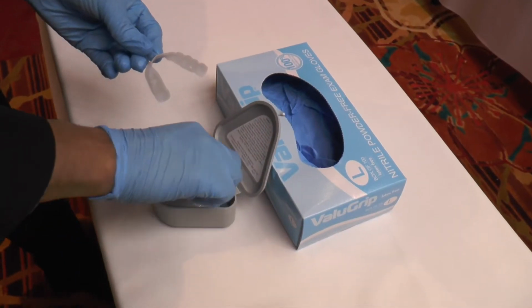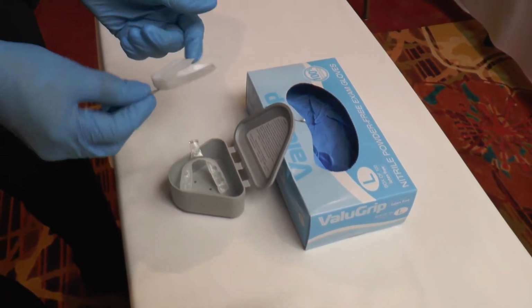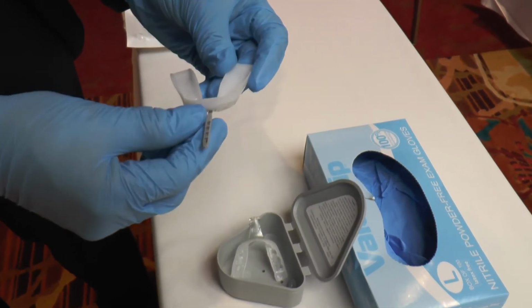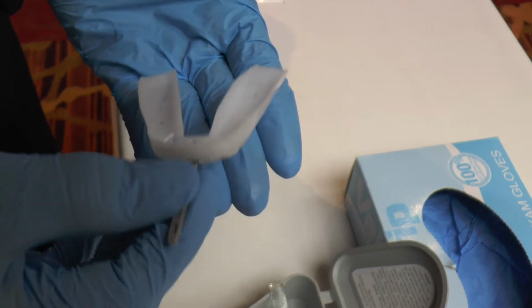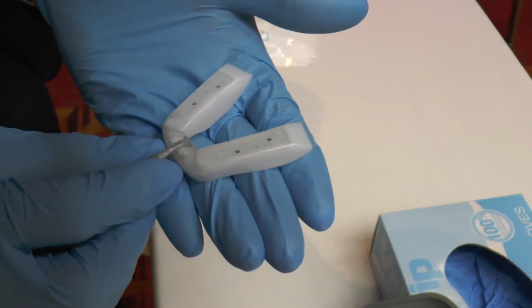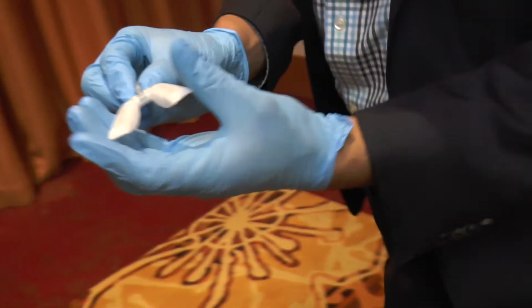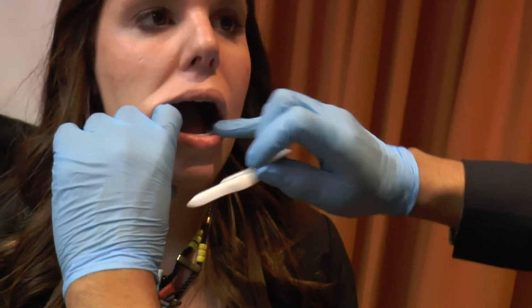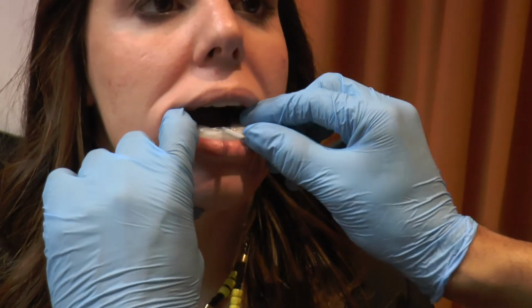So what we're going to do now is just set the upper tray in this carrying case and take the lower tray, and we're going to get it ready to be molded in the lower. The first thing, as always, you want to try the tray in to understand whether you have to modify it to allow a little bit better width or contract it to reduce the width on the tray. So before we put it in the warm water, we are just going to place it over the lower teeth. And once again, the point of reference is the nose.